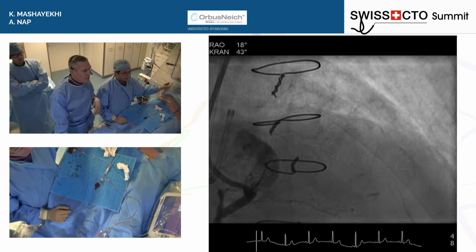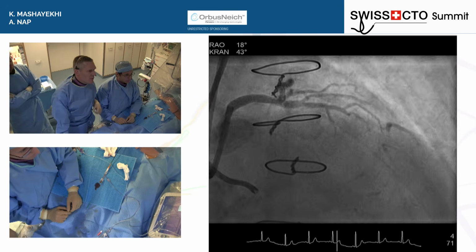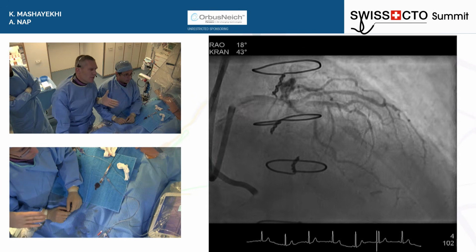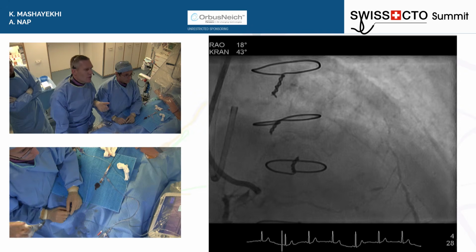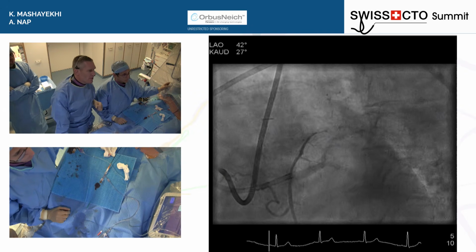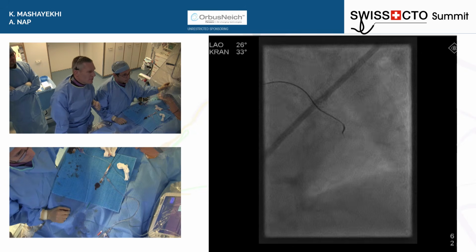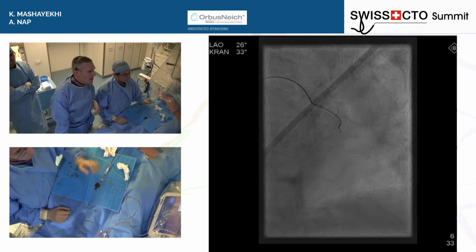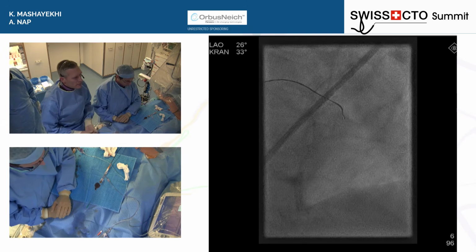So if we plan to do an ADR, we have to ask ourselves: are we going to lose, or probably going to lose, the diag, and is the territory small enough to do so? That's another question. You're going to lose it, but will you sacrifice it? That's another question when you do an ADR, unless you succeed and it doesn't penetrate. Unless you're able to penetrate, of course.